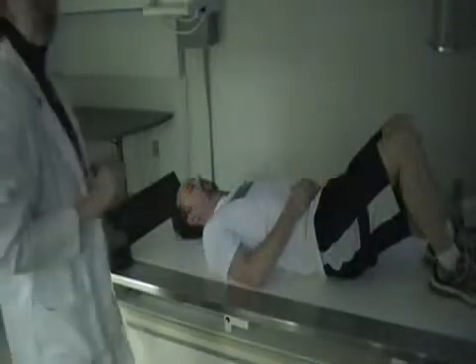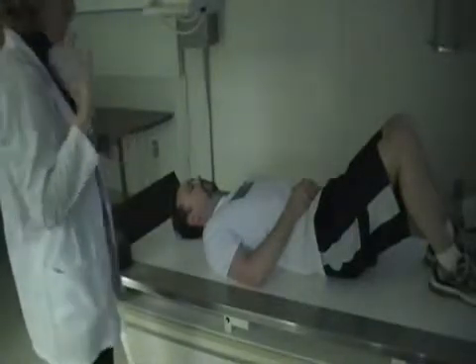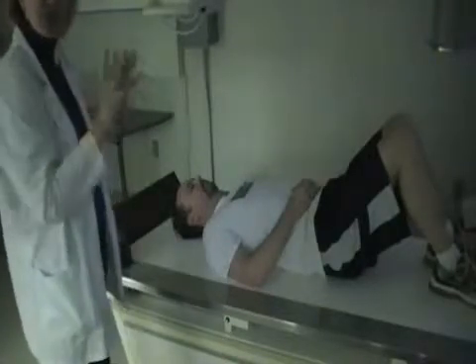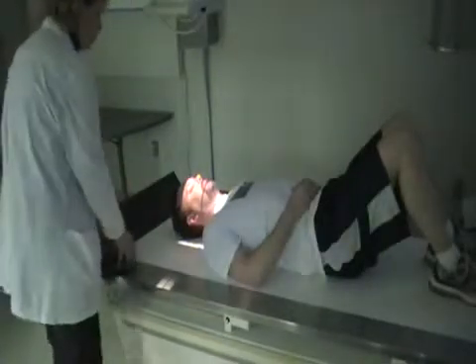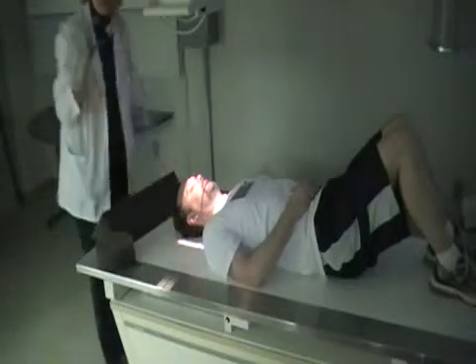Okay, now I'm going to show you how to do a cervical spine on the table. If you have a trauma patient, they're not going to be able to stand up for the rest of their images, so you're going to have to do it with them lying on the table. Now, I'm going to do the odontoid first, which, again, you're going to be centered since it's the open mouth.